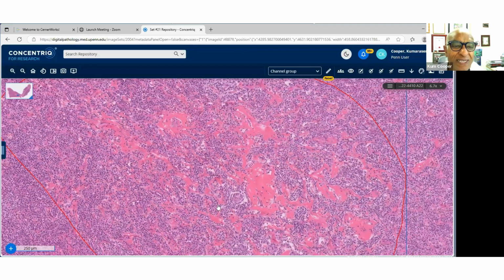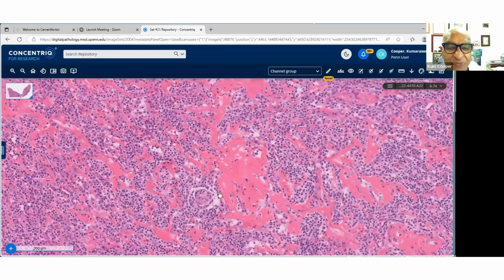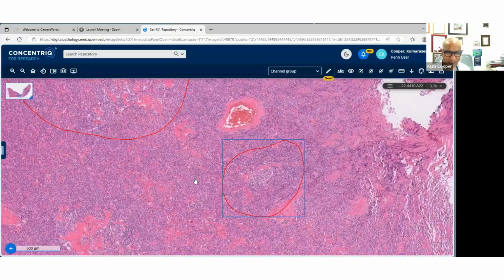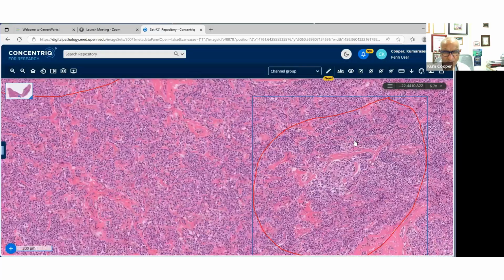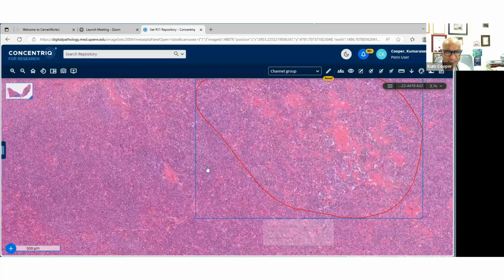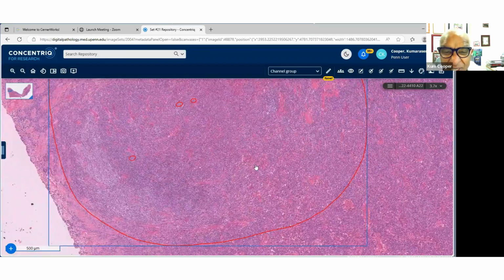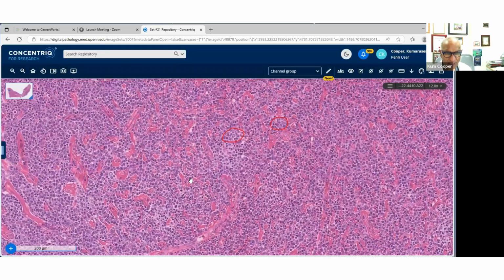Here we go. All right, these. Oh, okay. I've got the cells marked out. This is impressive. Yeah, I showed this at one of our ICCs, our interesting case conference. I must have shown it a couple of years ago. But here you can see these big cells, prominent nucleolus, vesicular chromatin. This has got 4 nuclei, prominent nuclear membrane, and they're quite easy to find under the microscope. Here's more of them here. Here's more. That's got multiple nucleoli, and you can see a somewhat irregular nuclear membrane there as well.